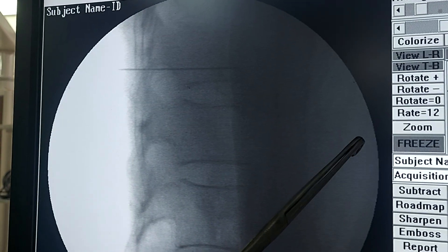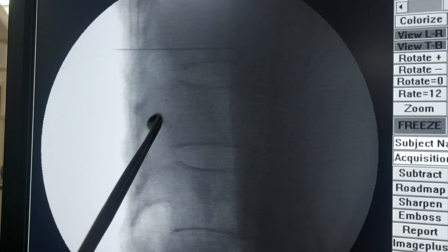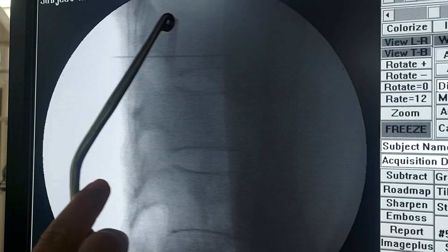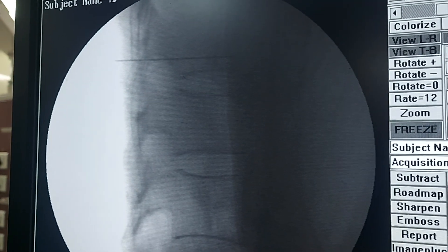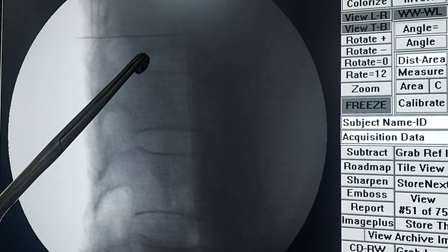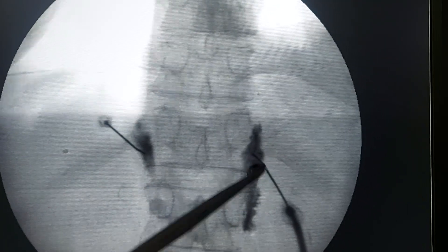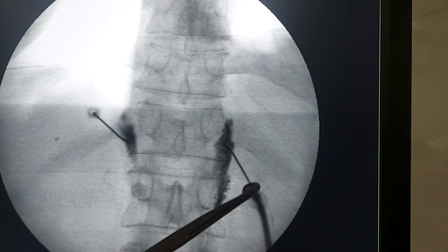In the lateral view you can see the vertebral body — anterior side, posterior side, vertebral body, intervertebral disc, canal, pedicles, and ribs. Our needle has entered a little anteriorly. Please try to hit the bone so you don't go too anteriorly. If you don't hit bone intermittently, take a lateral view. Then insert the needle on the opposite side using the same technique.